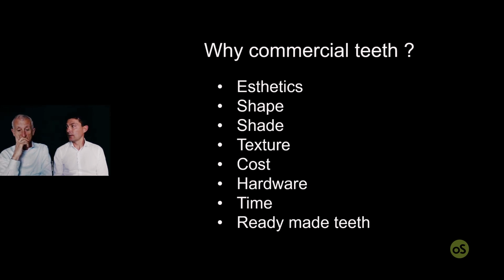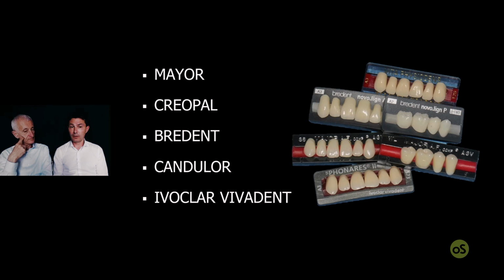Yes. Okay. And another big advantage of the commercial teeth, in the last generation, is the resistance, for sure, because in the top line of every brand, it is very important to have a good resistance.